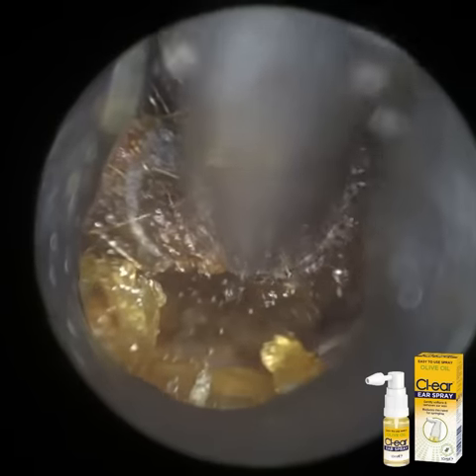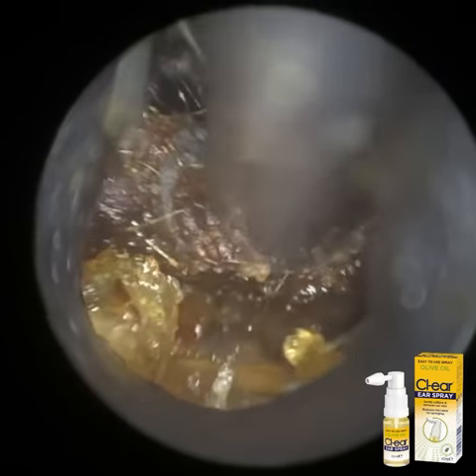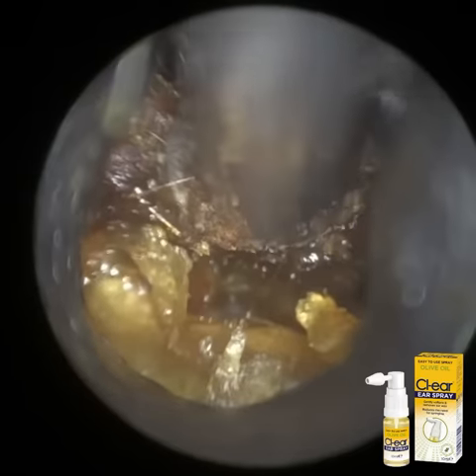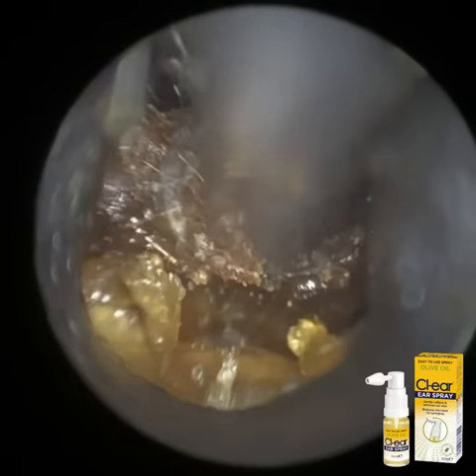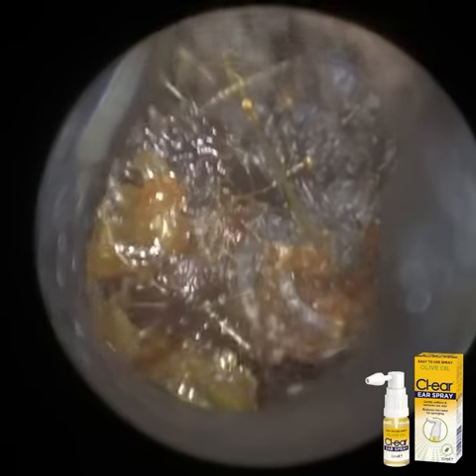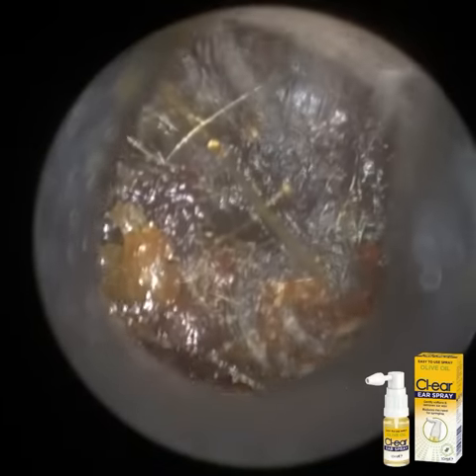That was originally lining the ear canal, and then that skin has died, and it's just in the process of shedding and migrating, and it's oxidized because it's been there for a while. It's turning yellow, and eventually it will get darker, similar to the plug of wax. Now, this wax is really, really lodged still. It's quite a severe impaction. It's up against the eardrum.